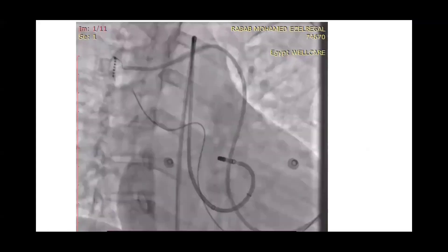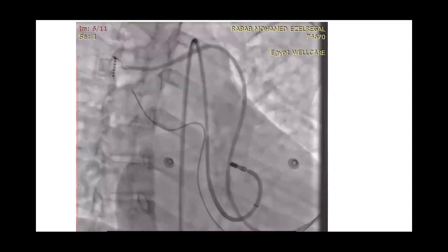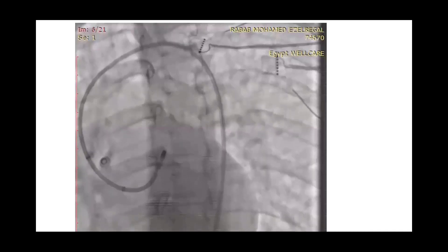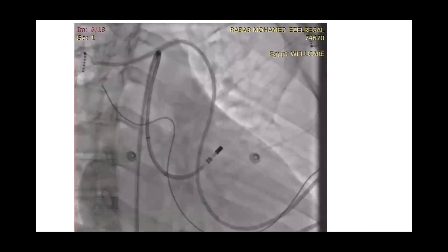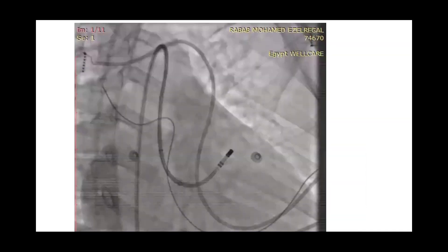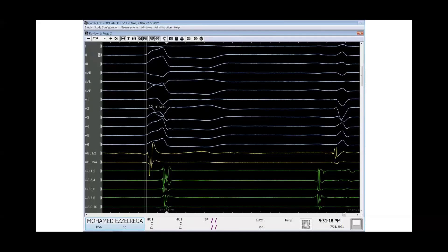Here is the RAO view of left coronary cusp mapping. With further mapping in the LVOT, we obtained a local activation time of minus 19 milliseconds preceding the clinical PVC QRS complex. With additional mapping we got minus 13 milliseconds. We were trying, as Dr. John explained, to exceed 20 milliseconds — either by the recording system or on the CARTO machine.